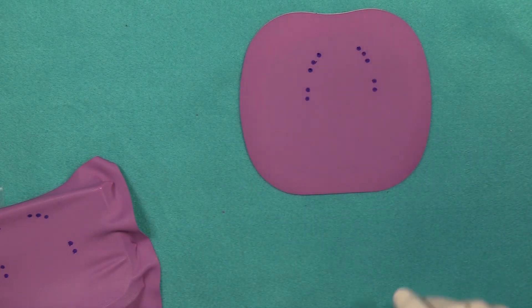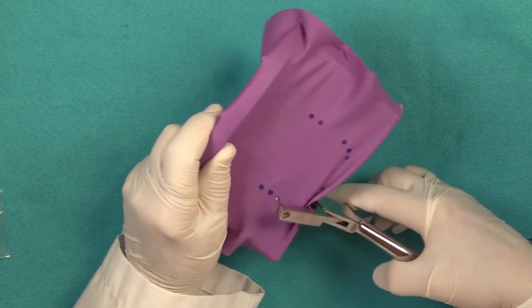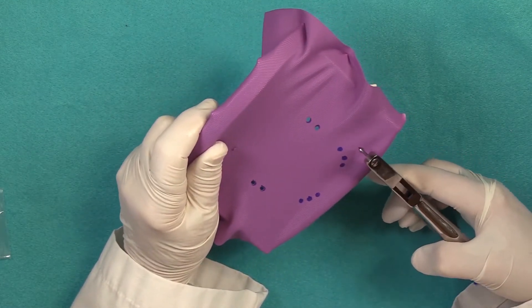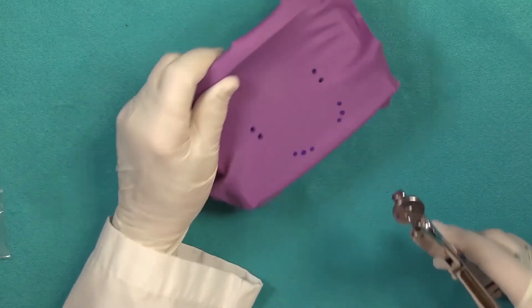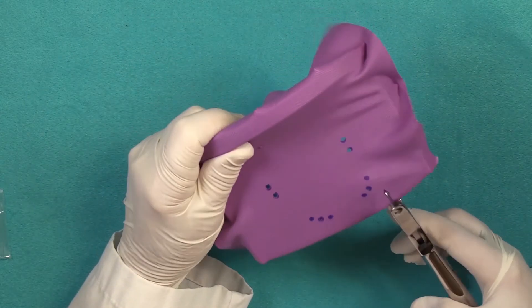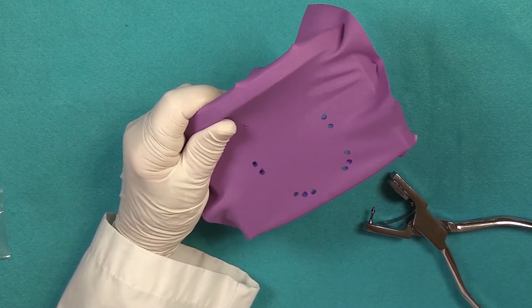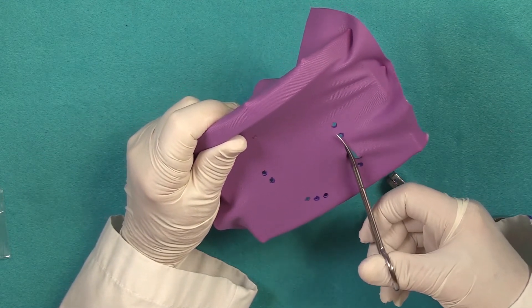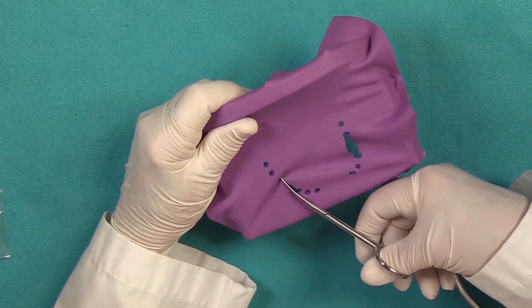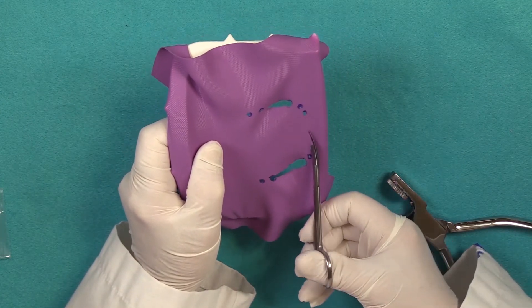If you're using the dam with the frame, while the dam is on the frame you can punch your holes for the anchor tooth, then punch the holes marked in front of the anchor tooth. For your canines, punch a slightly smaller hole — the number three hole on your punch. Then punch holes on either side of your canine, and you're ready to make your slits between each of those holes: one slit distal of the canine hole, and a slit on the holes on the mesial aspect.